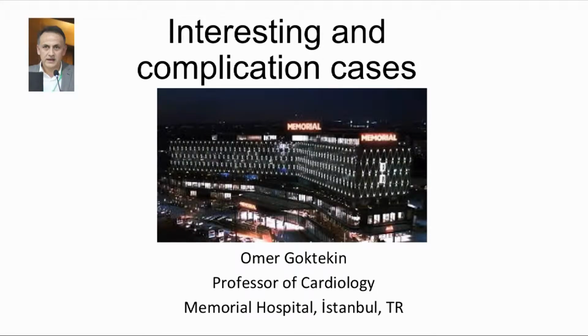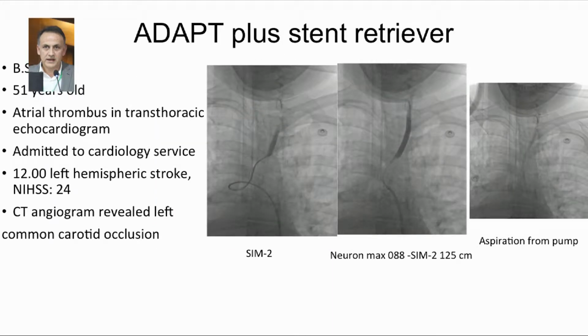I'm sorry. Yeah, I'd like to present some interesting cases and complications. The first patient is 51 years old, male. He had atrial thrombus in the transthoracic echocardiogram, and he was admitted to the cardiology service.